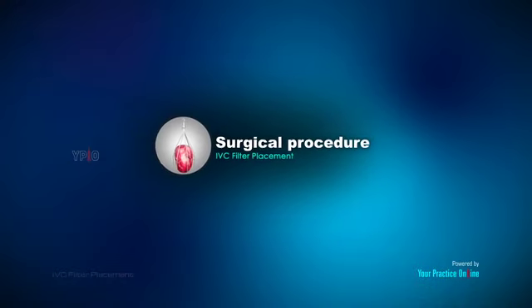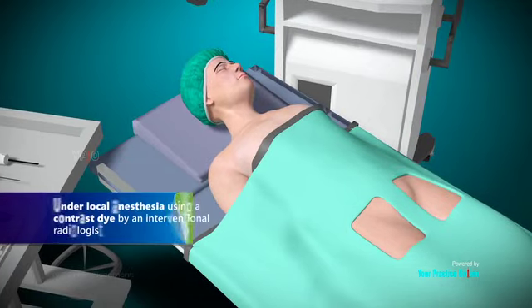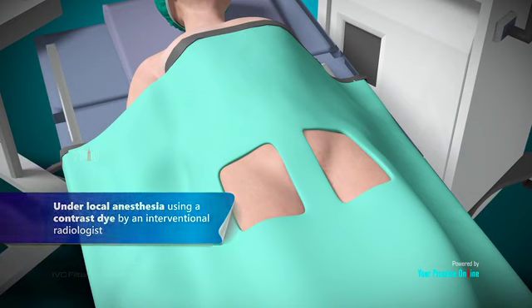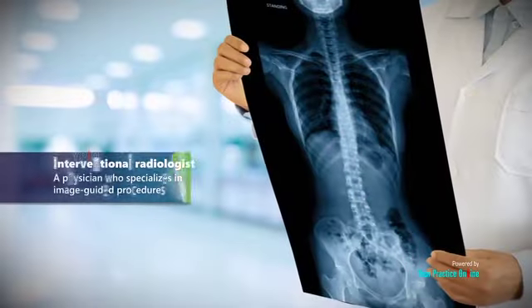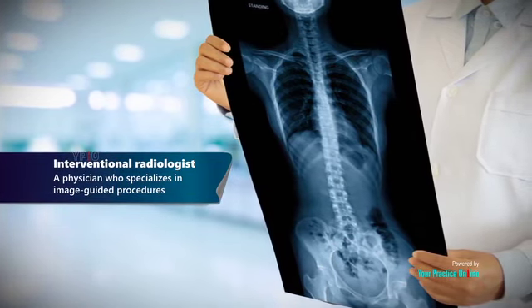Surgical procedure. IVC filter placement is usually performed under local anesthesia using a contrast dye by an interventional radiologist. Contrast is a special dye that makes it easier for your physician to view your internal organs during the procedure. An interventional radiologist is a physician who specializes in image-guided procedures.